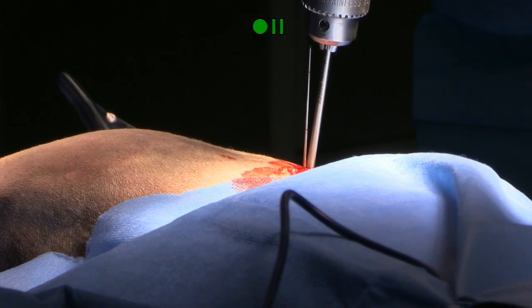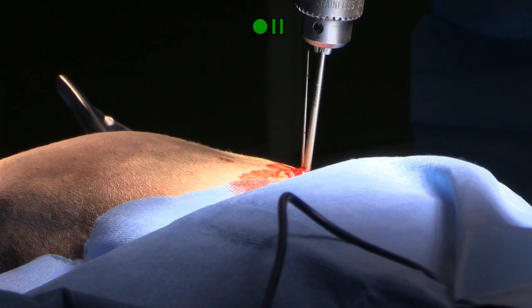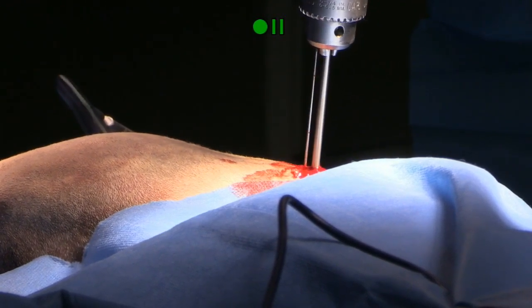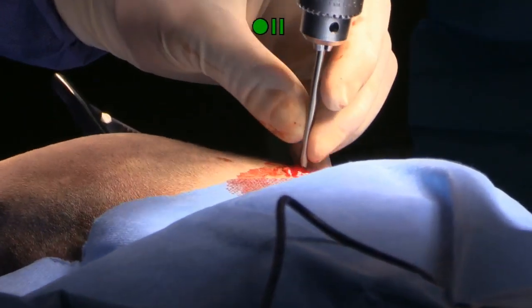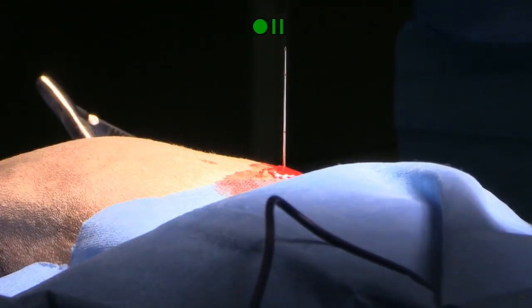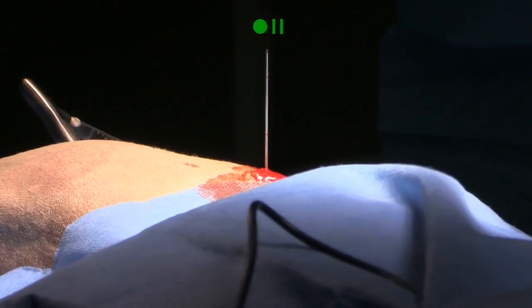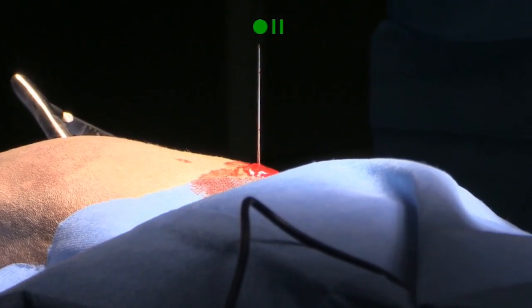And while I can't see where this hole is, I can feel where the drill bit's kind of dropping into it, so I'm just going to... Do you want to use a non-cannulated? Yeah, can we get a non-cannulated 3.5? Just going to slide a little tip on it.